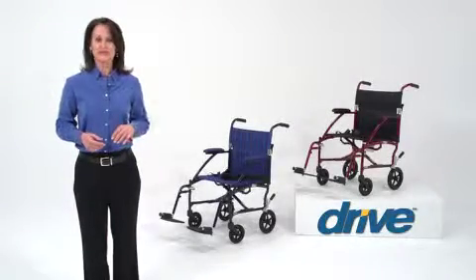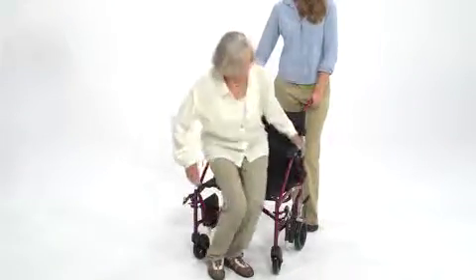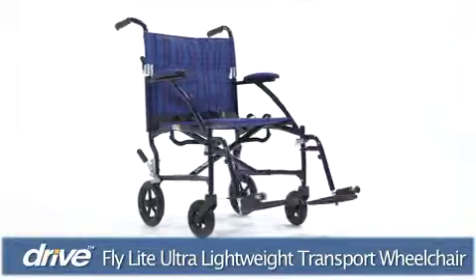One of life's great joys is being able to spend time with family and friends. With the assistance of a companion or loved one, someone with limited mobility can sustain their social interactions and activities by using Drive Medical's lightweight Fly Light Aluminum Transport Chair.